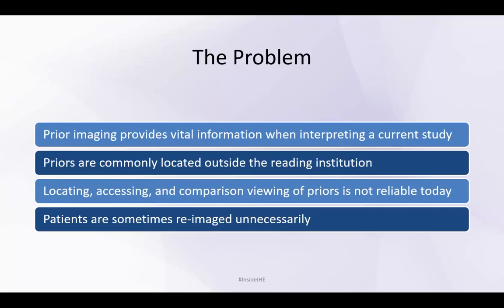The last thing Dr. Smith wants, and me too, is to have to access a separate website, even if it was to use a single sign-on. He doesn't want to have to search a separate database. He doesn't want to wait for images to load, as it would slow him down too much through a very busy workday. To make things worse, Dr. Smith may have to open two separate web interfaces, one for the images, another one for the report.